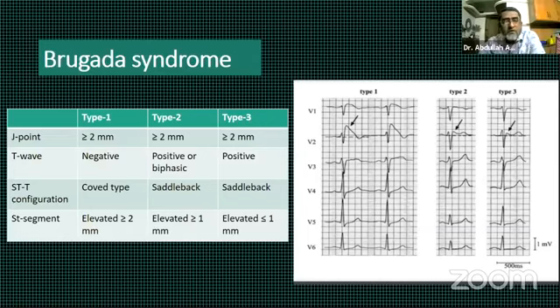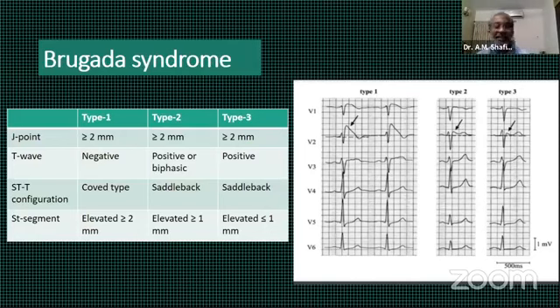But did you do this for this patient? What management have you given to this patient? This patient is symptomatic. We could not yet detect ventricular arrhythmia, because we did 24-hour Holter ECG monitoring. Later on, we suggested 3-day Holter ECG monitoring if the palpitation still persists. If the patient's palpitation persists, he will come and we will do 3-day Holter monitoring. If we can document ventricular arrhythmias, then we will definitely put in an ICD for this patient.